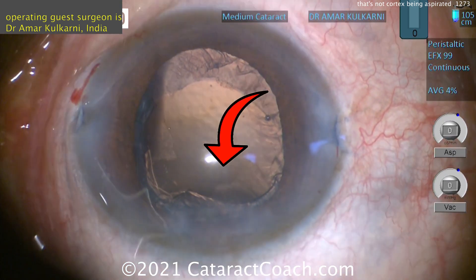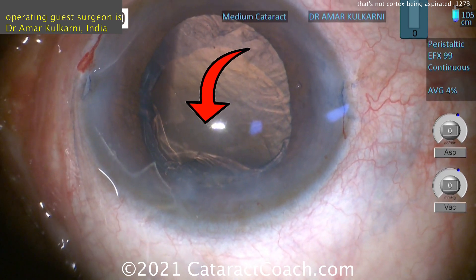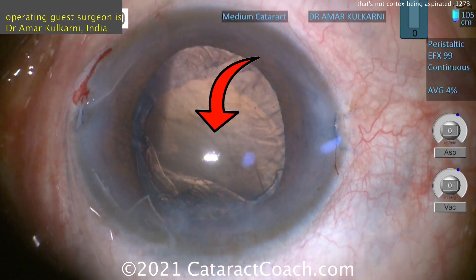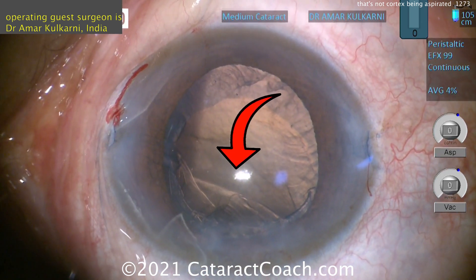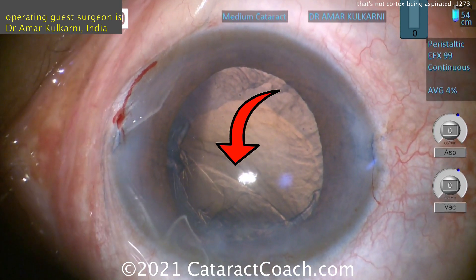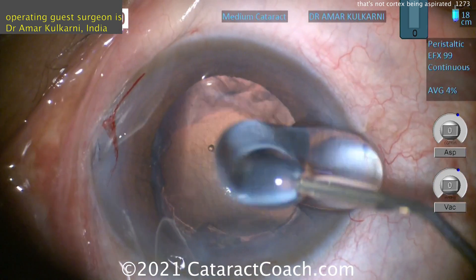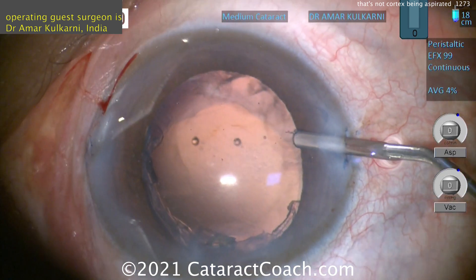But you've got to be super cautious. That's the area right there. All surgeons have had this issue where you go to clean up some of the cortex and that capsulorhexis edge moves. You see all those linear wrinkles of the capsule — that's not what we want. So viscoelastic is your friend here, to re-inflate the capsule bag.